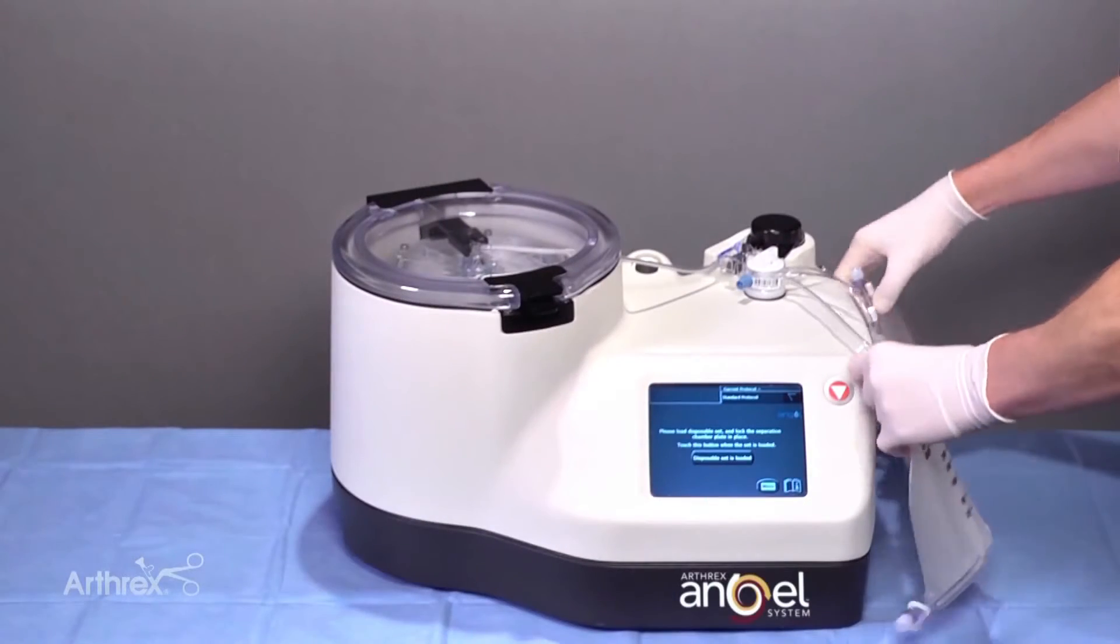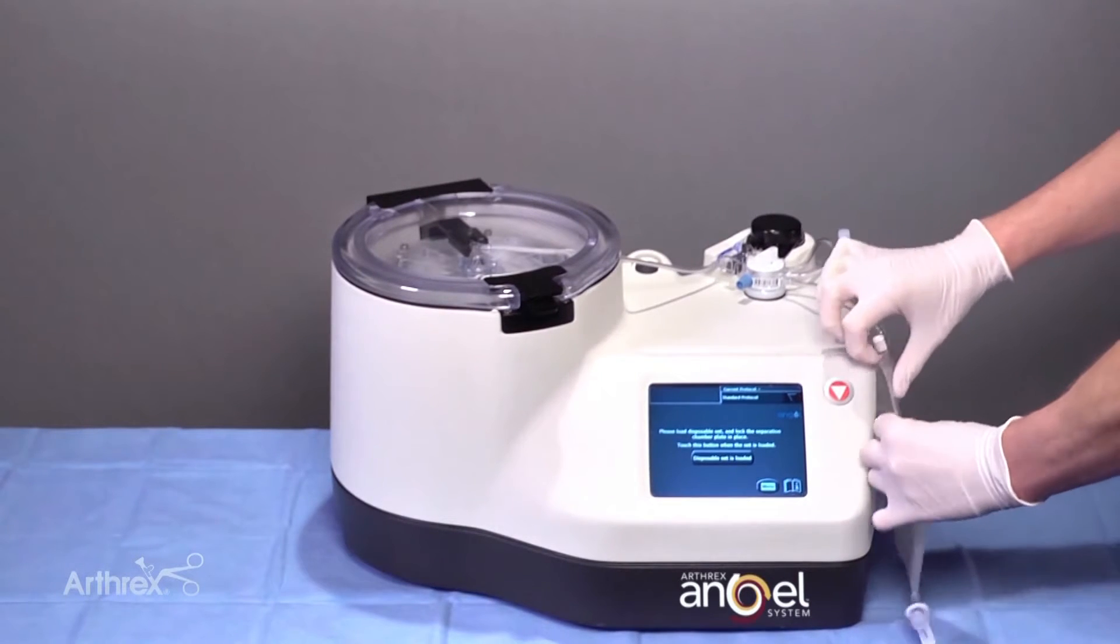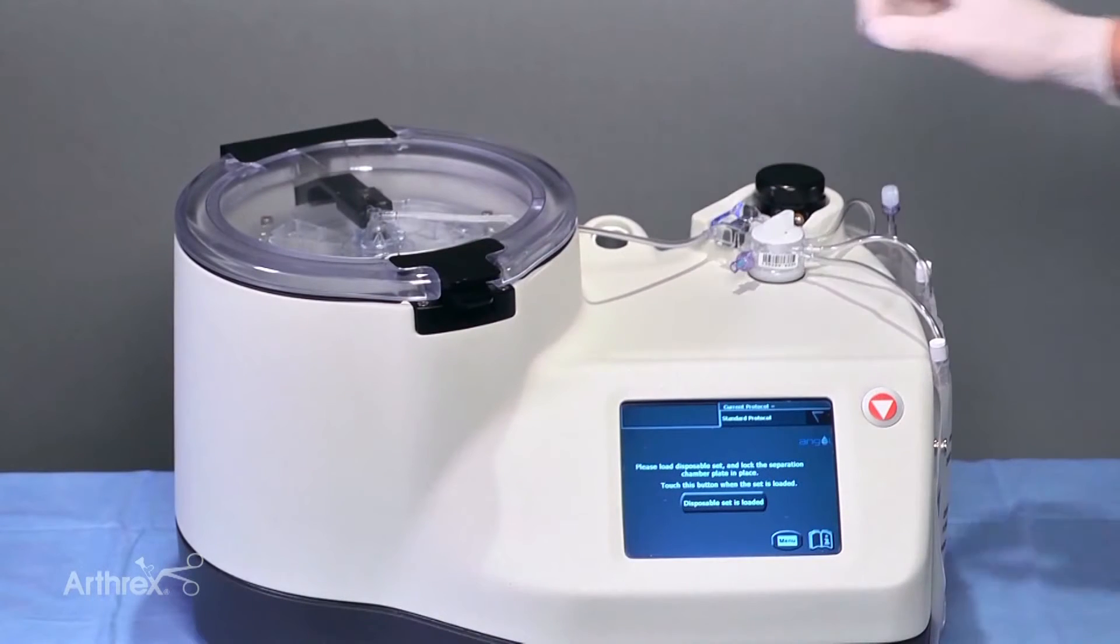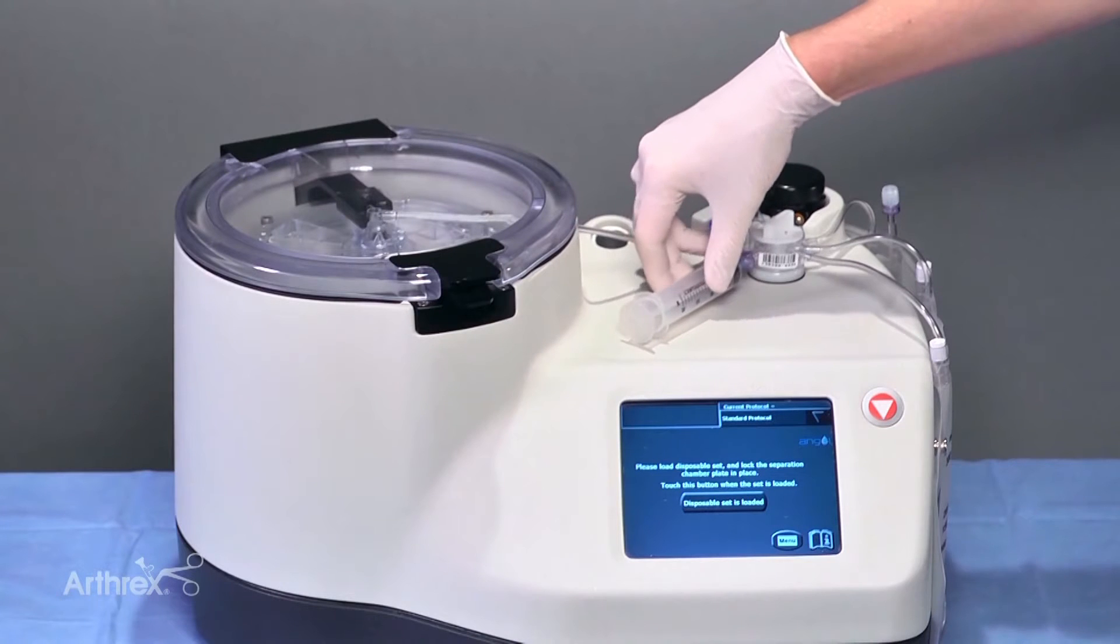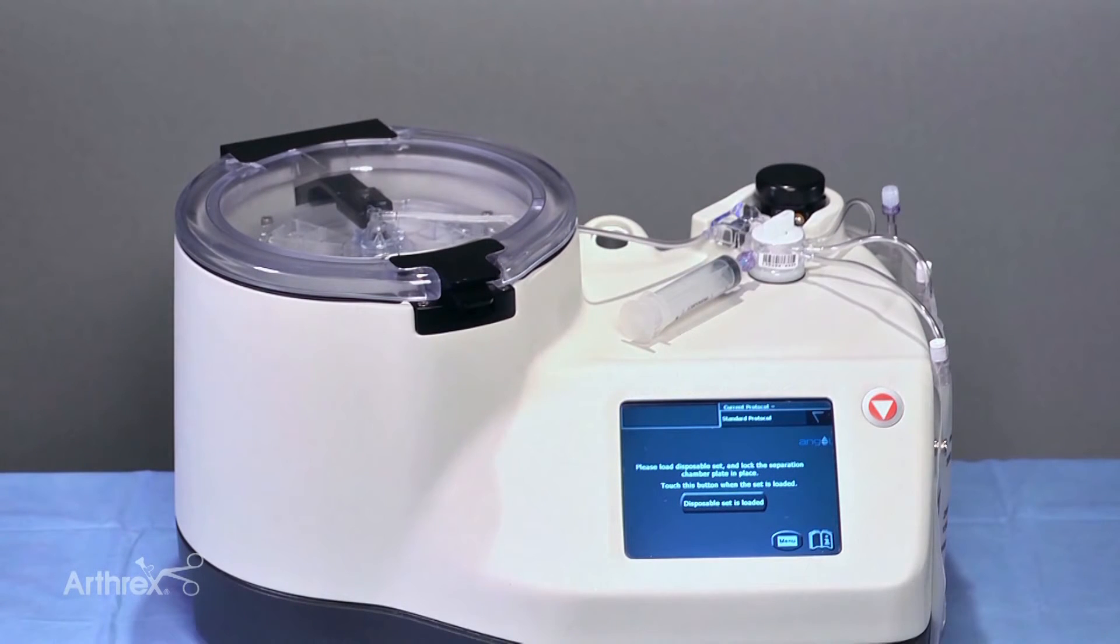Hang the three compartment reservoir bag on the two support pins located on the side of the Angel machine. Attach the PRP collection syringe to the PRP valve port. The Arthrix Angel system is now ready to use.